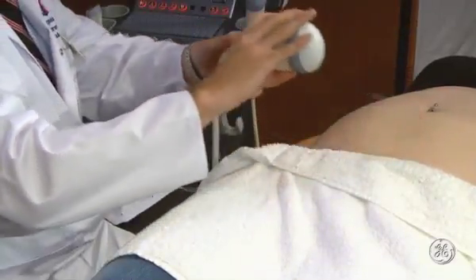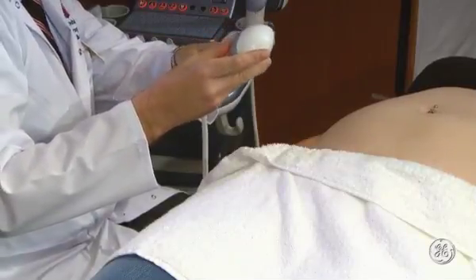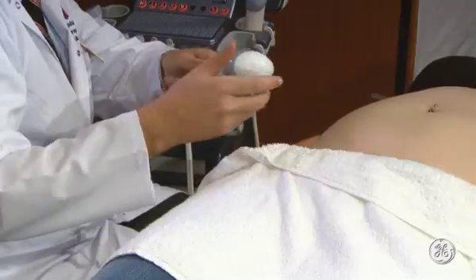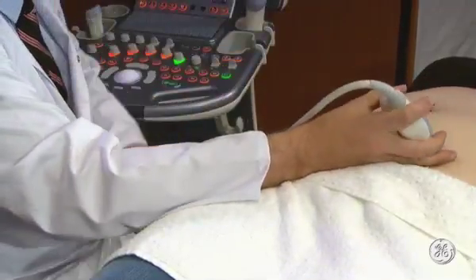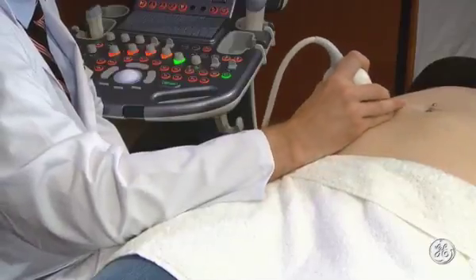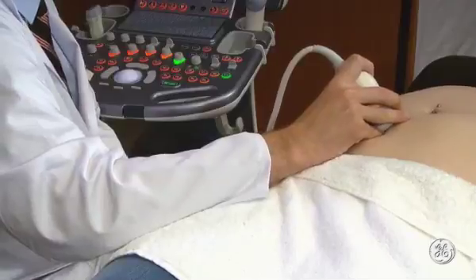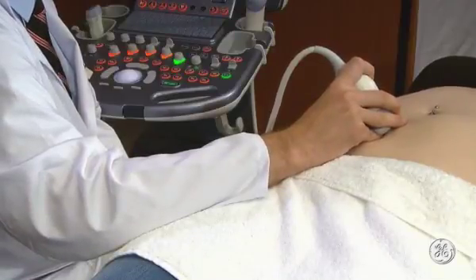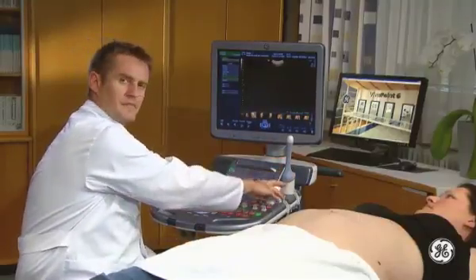I will demonstrate the way of holding and moving the transducer with my coworkers. We place the hand first, afterwards the transducer, and we move it together. This guarantees stability on the patient's abdomen. After these very basic tips regarding the probe, I will move to image optimization.